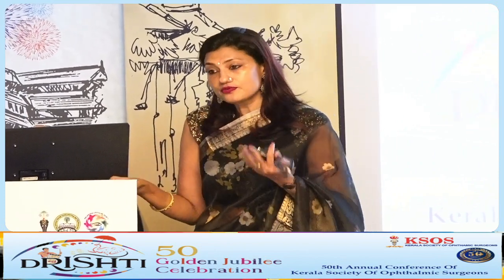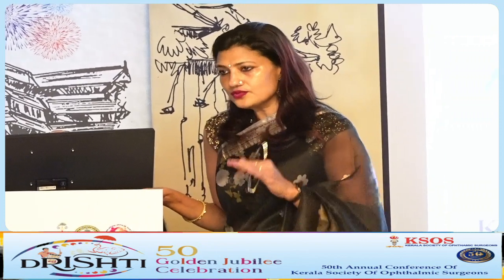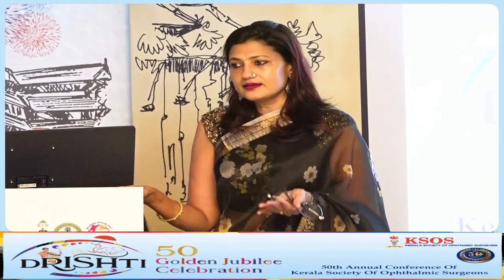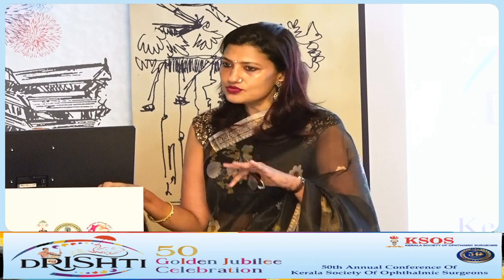It will show before the visual acuity drops, but again we can't use it as a screening tool because it is not widely available. So as of now, visual acuity, visual field, color vision and pupils are the way to screen, especially visual field, the 24-2 or the 10-2.